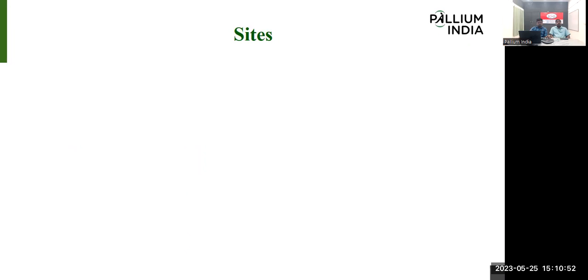Then we can move to the sites of injection. In which sites can we give the subcutaneous injection? Anterior abdominal wall. Okay.